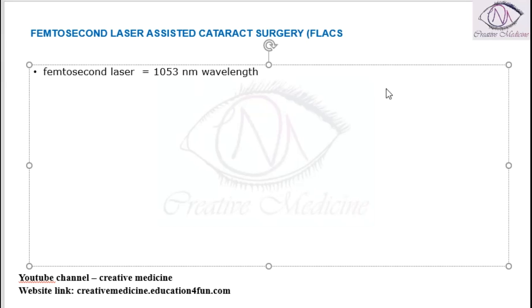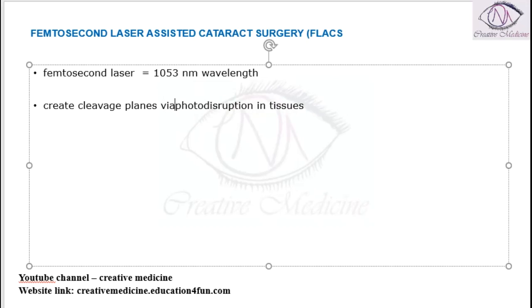This femtosecond laser is mainly used for creation of cleavage planes. It is used for creation of cleavage planes via the photodisruption of the tissues. It will damage the tissues and thus creates the cleavage planes.